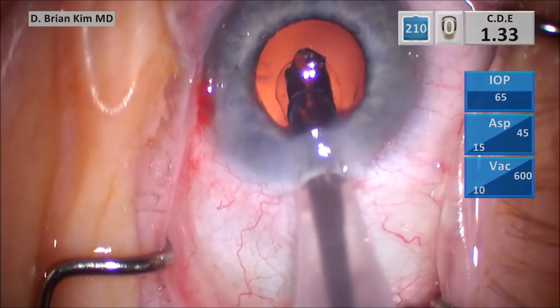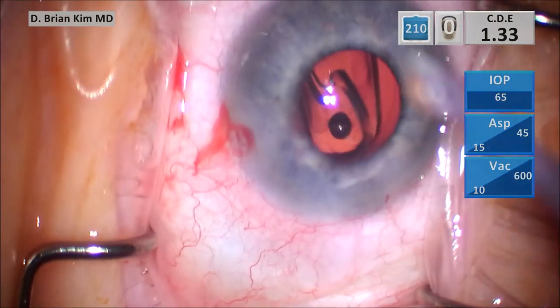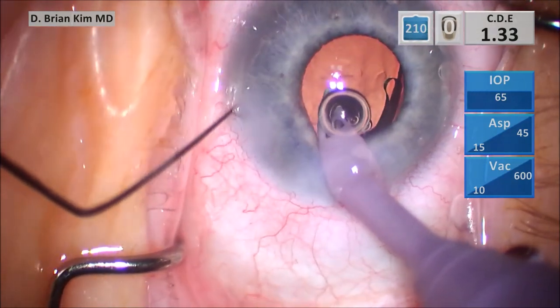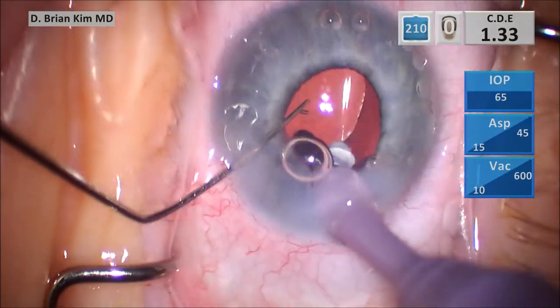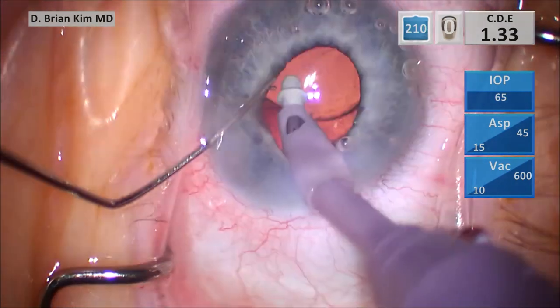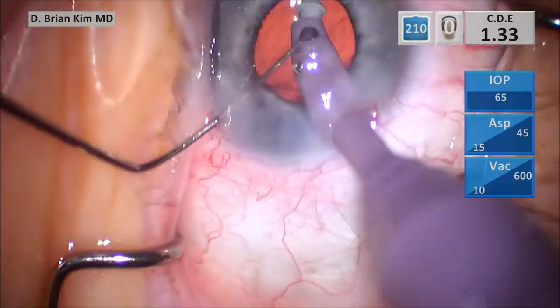I go straight to the lens and inject this single-piece acrylic lens into the capsular bag, then go straight to the IA. But as I do this I also use a Maltzman hook, disengaging each haptic — the leading and then the trailing haptic. I like to use this Maltzman because it really helps me make sure I am definitely in the bag completely, given the limited view from this small pupil. As I turn the lens, lo and behold the lens is not turning right — so I figured it's not completely in the bag. Sure enough, the trailing haptic is not in the bag, and that's why the 90-degree clockwise rotation is very helpful, because otherwise the lens should tilt and turn easily, and it did not happen in this case. I was able to tuck that trailing haptic right into the bag.